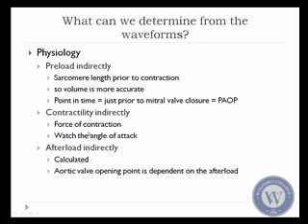What can you determine from these waveforms? Well, first of all, you can determine the physiology that's taking place in the heart. You can determine to a certain degree the preload of the heart. The preload indirectly is measuring the sarcomere length prior to contraction. So volume would be a much more accurate measurement, but in essence, what we use is the understanding that pressure is sort of related to volume.